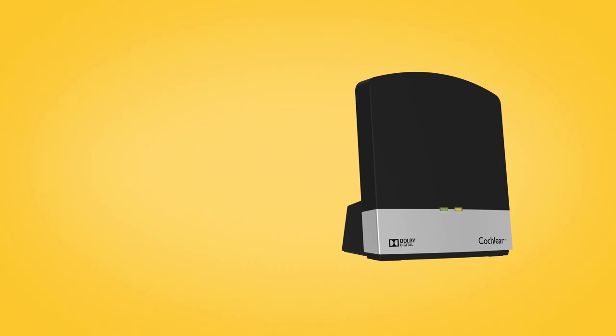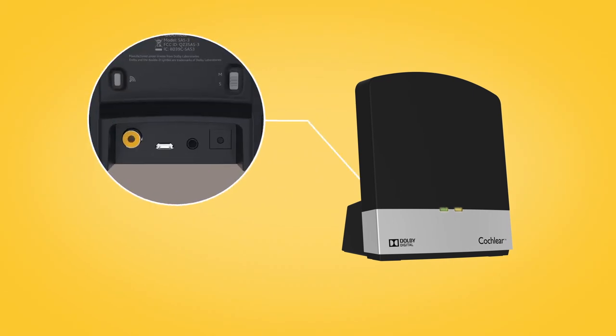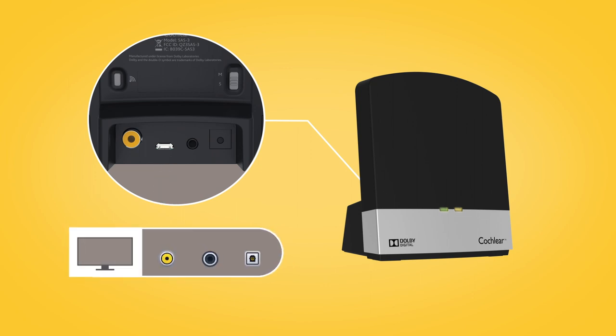To use the TV streamer, plug it into the wall using the power cord, then connect your TV streamer to the audio source using the audio cable.